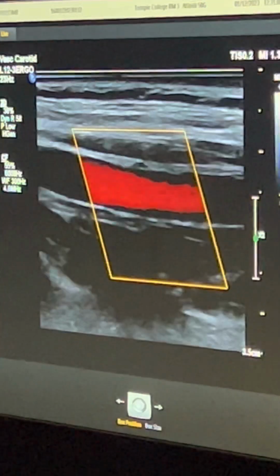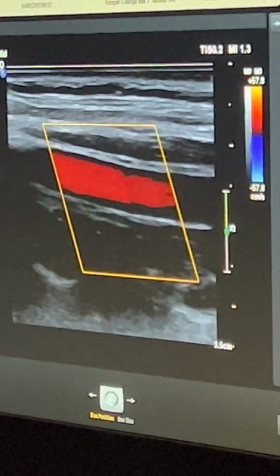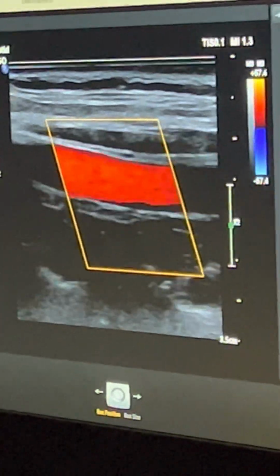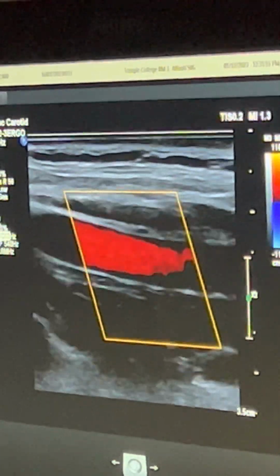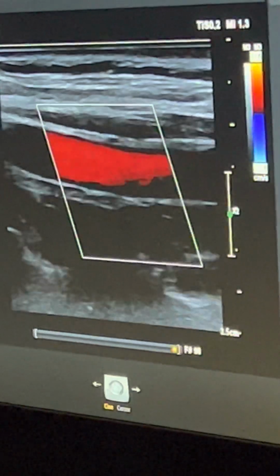Okay. Another thing, let's talk about the gain and stuff. I know y'all haven't really been into that too much, but we will start grading on it this time. I jacked my scale up to 116. What's the problem here? It's not filling the vessel.